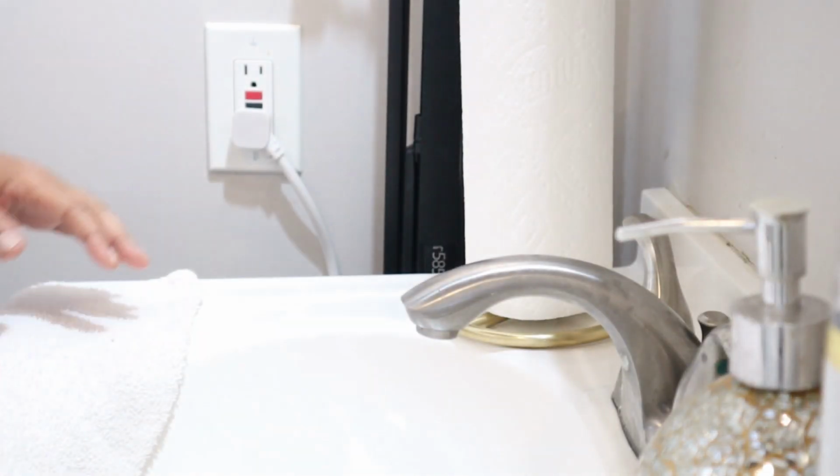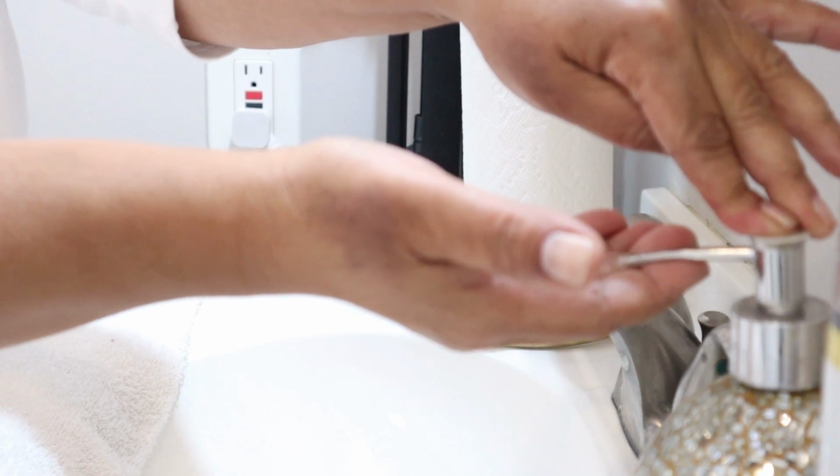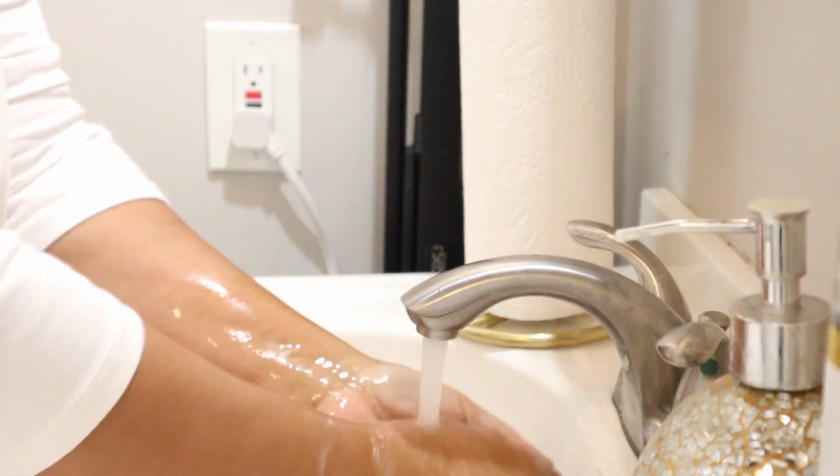And then you'll be set to start the nasal rinse, okay? Now, before I begin the actual procedure, which doesn't take long at all, I always wash my hands so that I'm not contaminating the bottle. So what I do is I wash my hands, and then I begin to follow the instructions on the package. Okay, so it says first, I'm gonna just read it.